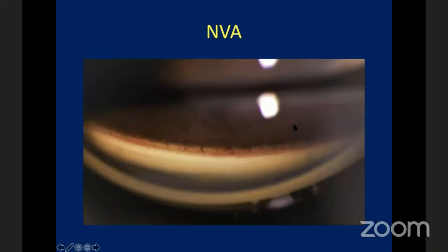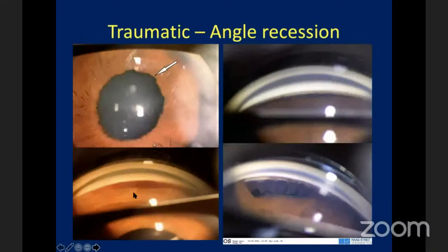This is a patient of a central retinal vein occlusion, and you can see the new vessels. These are diffuse, irregular, arborizing vessels crossing the scleral spur. So that is a pathological neovascularization of the anterior chamber angle. Very important thing to do undilated gonioscopy in diabetic patients and vascular occlusions, to identify this. The patient requires immediate pan-retinal photocoagulation.